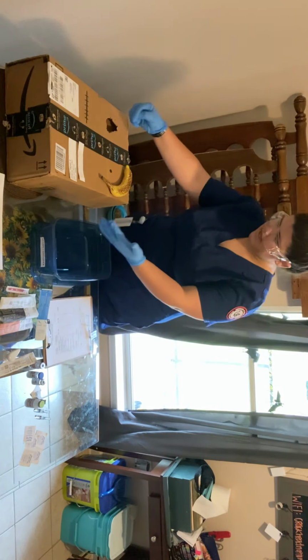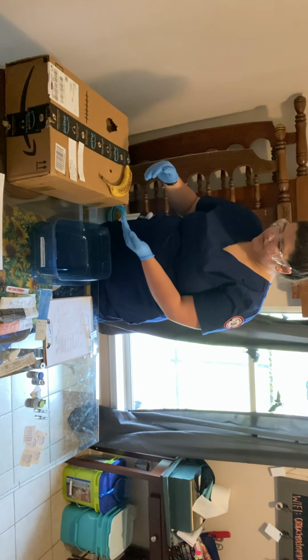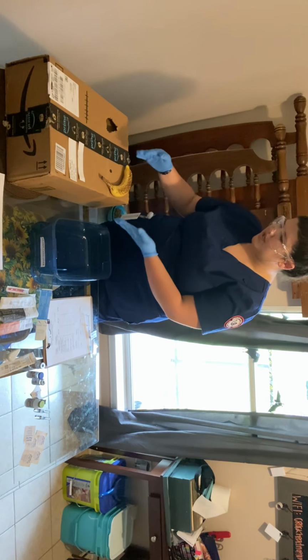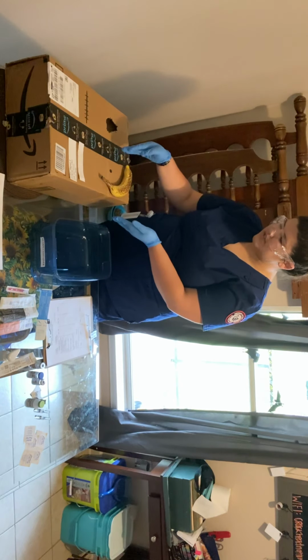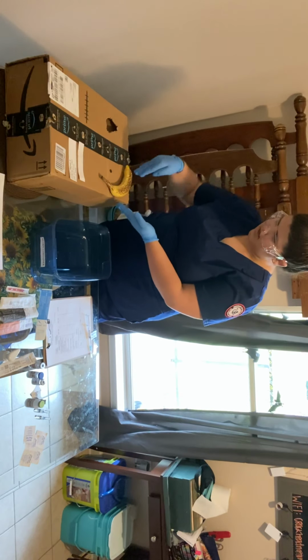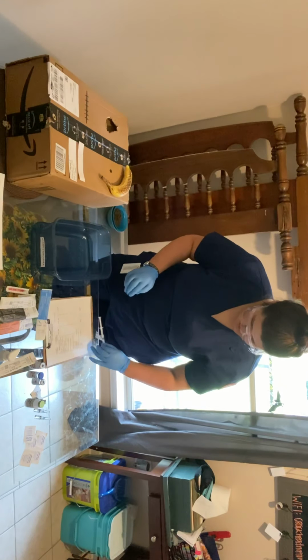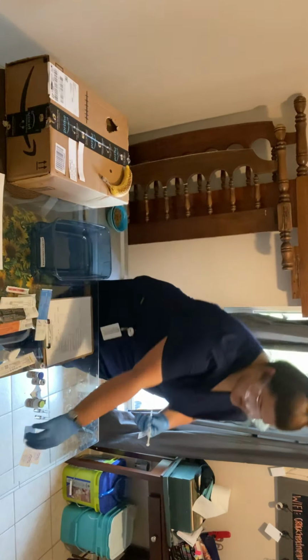I would remove his gown, and I'm going to inject in the abdominal area since it's a subcutaneous. I'm going to have certain regions, so my region is going to be below the costal margin, above the pubic area, and in between the sides of the anterior superior iliac spine. So it's going to make a U, and I'm going to stay away from 2 inches of the umbilicus. So I'm going to take my medication and an alcohol prep pad.